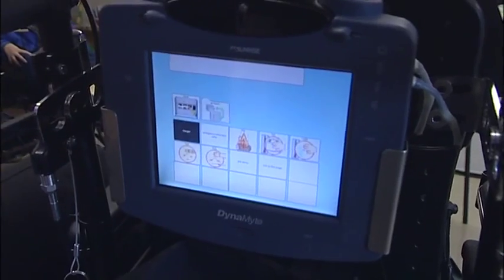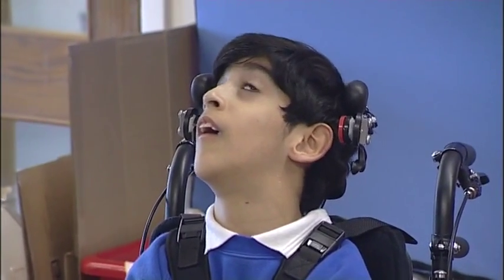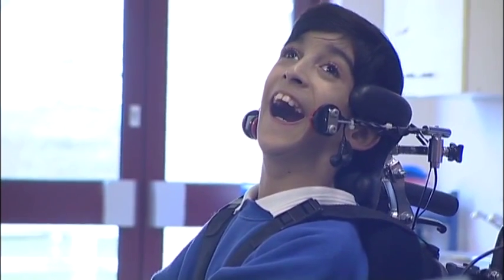He has 2 switches. One side he uses to scan, so it moves along the available vocabulary, and then the other side he uses to select and then speak. No, he actually took to it pretty well. I think the greater difficulty is actually presenting him with the right choices. Well, I should say for most people it would be very difficult to remember a multi-layered structure, and he has to effectively remember all the various choices that the machine offers him. And I think that's far more challenging, in a way, than actually hitting the switches.